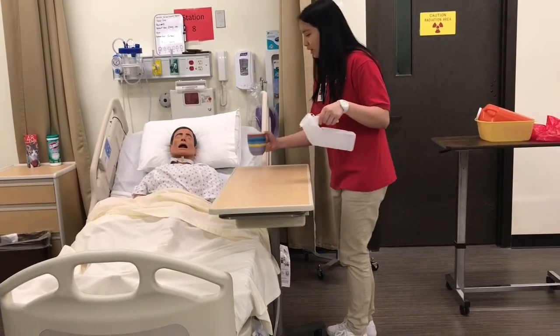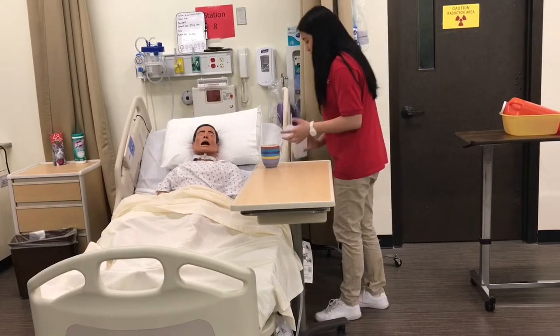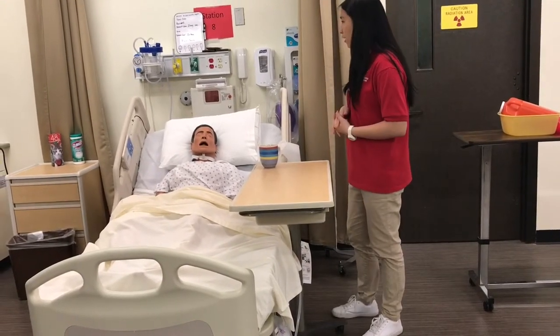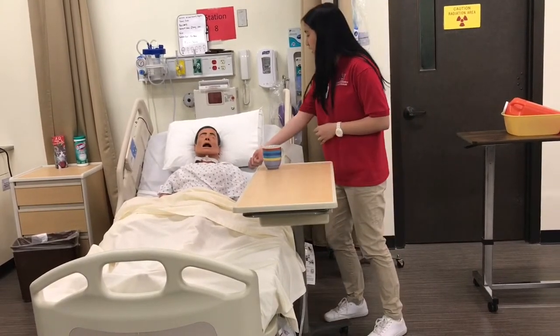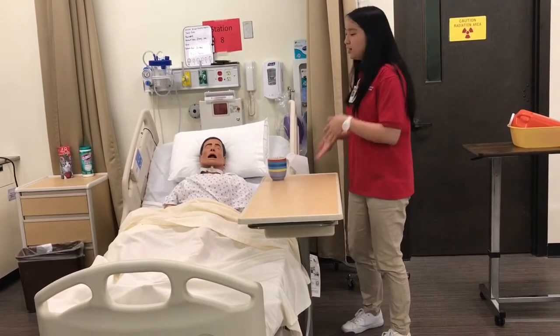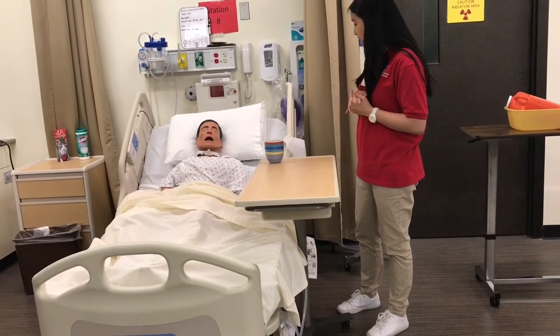Hi, my name is Sherry and I'll be your nurse today. Officially from now we're going to be starting the 24-hour urine collection. Here's your call light. Anytime you feel like you need to urinate, press the call light and I'll come and get the urine. Do you have any questions?